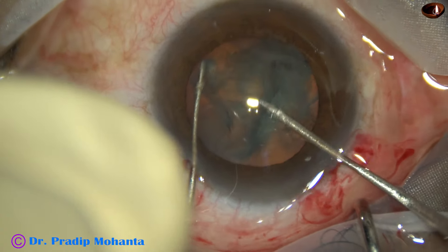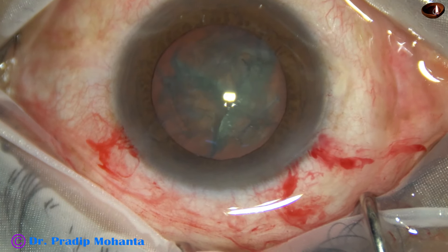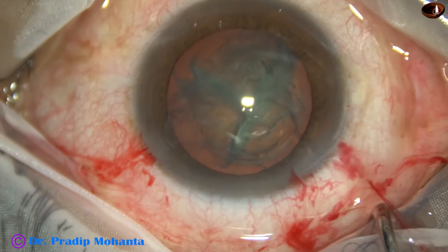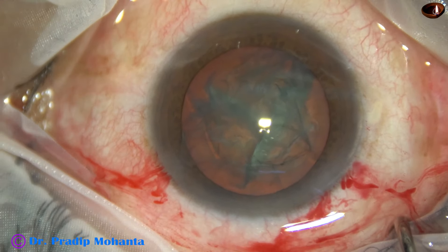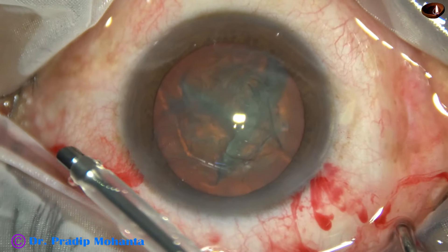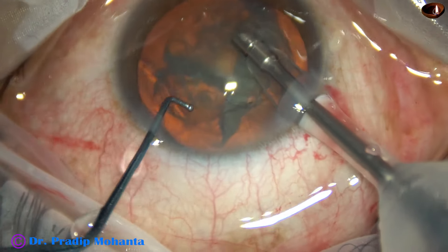Two hemi-nuclei are created, and then one hemi-nucleus is divided into two fragments, and then I come out. Now the anterior chamber is again filled up with visco, and the handpiece is taken. Then the phaco nozzle is placed beveled down and it goes into the anterior chamber.